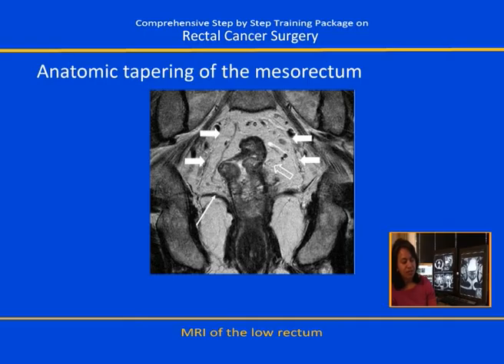And I think here is really where the problems start, because you start to see the mesorectum tapering and narrowing down deeper in the pelvis, so that if for example you were to attempt the TME operation and take yourself over the surface of the levator, you are drawn towards this angle here between the levator and the rectal wall where there's tumour coming through.